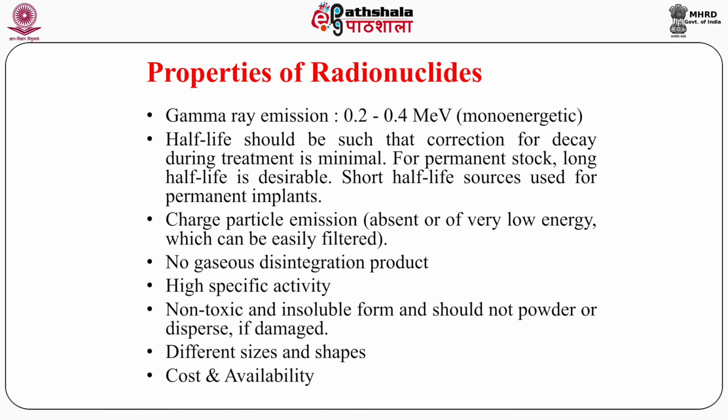Now, if half-life is very short, then we have to replace the source very frequently, and during treatment also the correction is required. So the sources which are used should have sufficient half-life, a long half-life, so it can be used properly. Its calculation is much better. Planning can be done in a proper way.